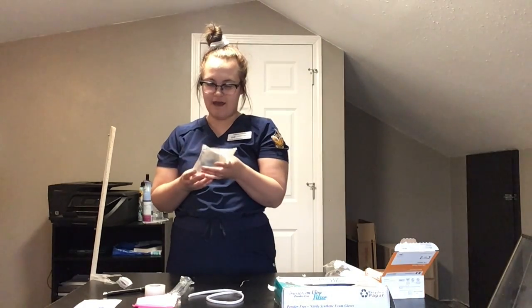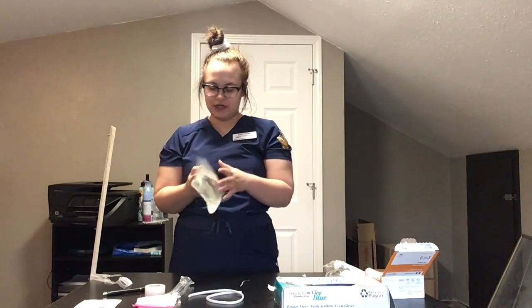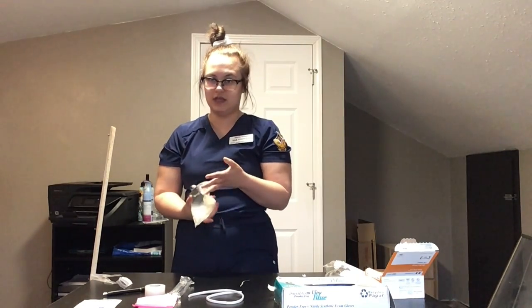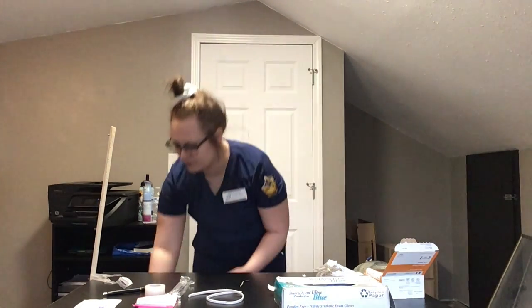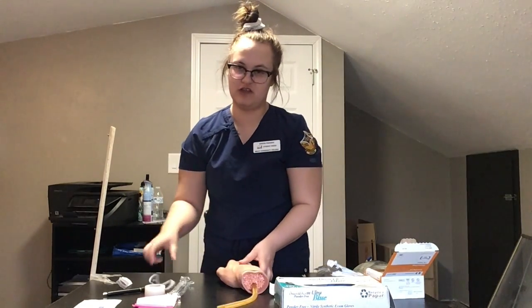Then I would check that for the expiration date. I would check it for any particulates, any discoloration, any holes, anything abnormal that makes it seem like it wouldn't be safe to give to my patient. So then after I've checked that, I would identify my patient using 2 patient identifiers. So this is my patient today, and I'm going to identify him using his name and date of birth that I checked on his wristband.